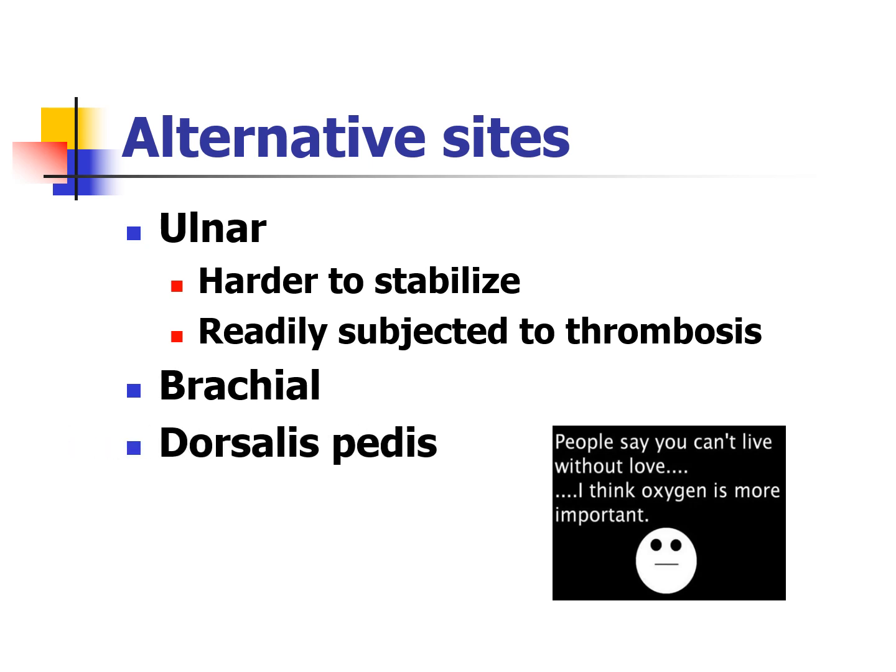Brachial location and dorsalis pedis. The brachial location we already talked about. The dorsalis pedis, top of the foot, for spinal cord injury patients, quadriplegics or tetraplegics. Not great if someone has diabetes, right? Bad idea for those patients. In theory, you could do the top of the foot as well. I've only done a couple of these.